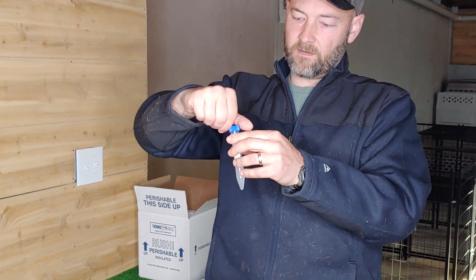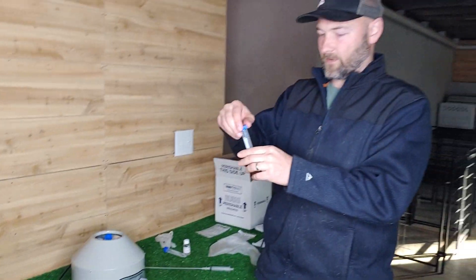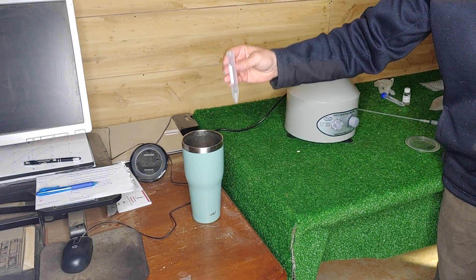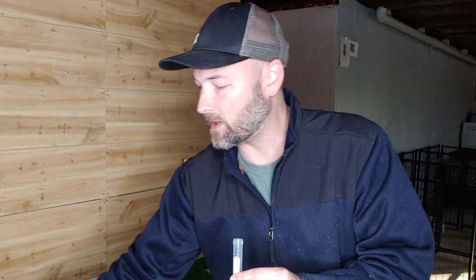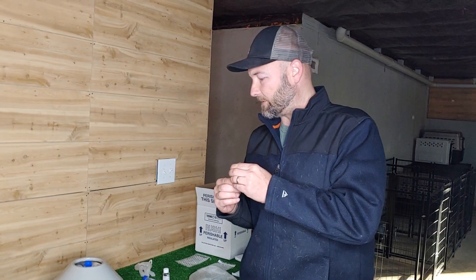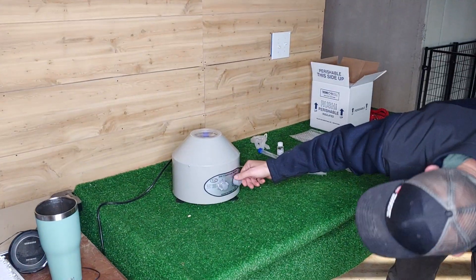Now we're going to close this, make sure it's good and tight, and then put this in our centrifuge so we can thin the semen down and separate the seminal fluid from the real sperm-rich semen. I'm going to take another tube and get about six milliliters of water to balance it, because I don't want it to be off balance and shaking. Some people will use hand sanitizer — just anything to balance it. I always put the dog semen in at number one, and then the balancer directly opposite it.